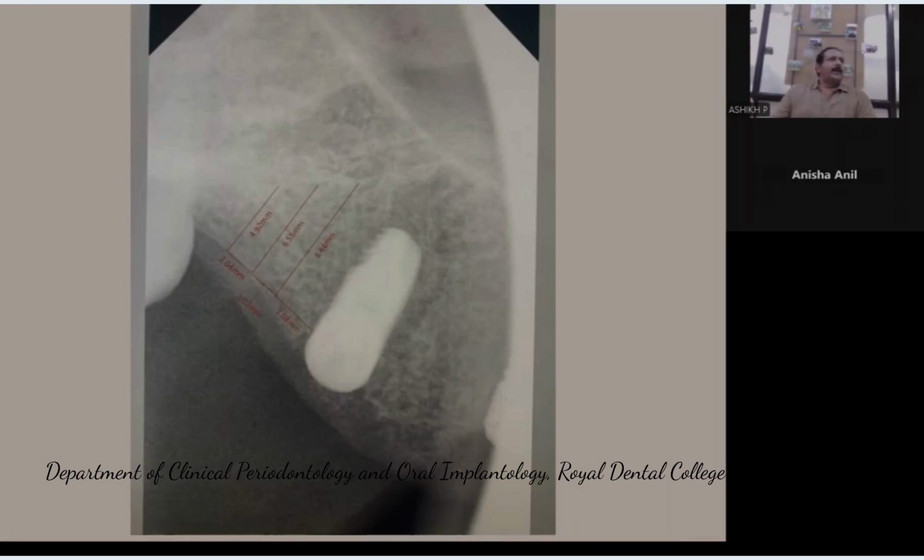Beyond the sinus floor, you don't need a preparation because you don't have any bone within a cavity. So it's just a floor fracturing, thereafter implant placing. But here, if at all you have to place it more than 2 millimeters, then push graft into the fractured area. Then place the implant, so the implant will flush with the bone. That means 8 millimeters of complete implant has gone inside.